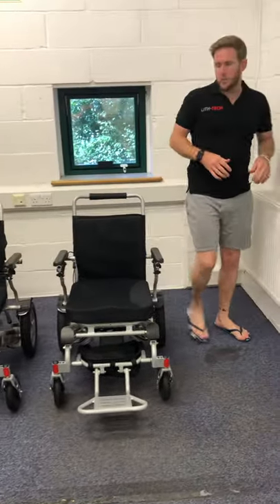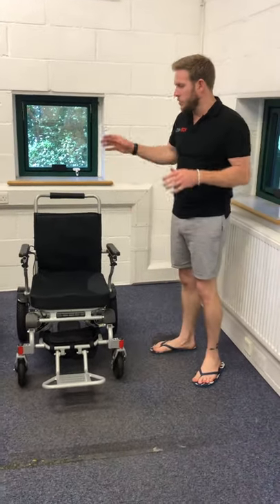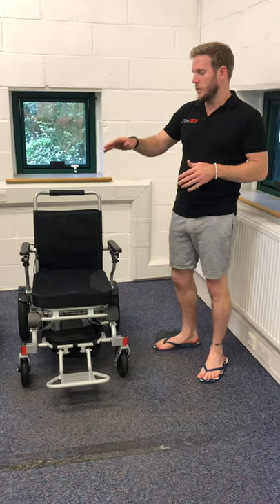What's been upgraded on this chair from the Smart Chair 1? It still has the same foot plates, same armrests, same quick folding mechanism which we can do in one to two seconds. It's got the same motors, same controller handle, same joystick.